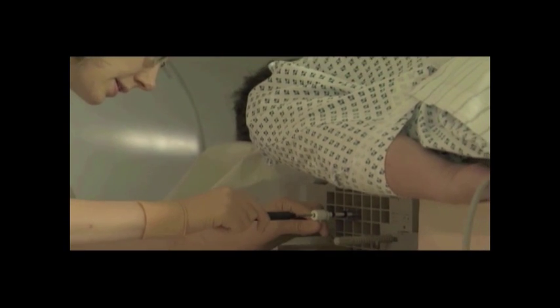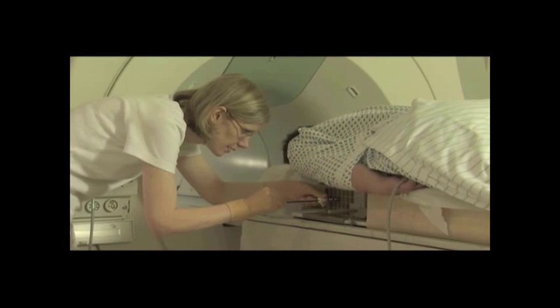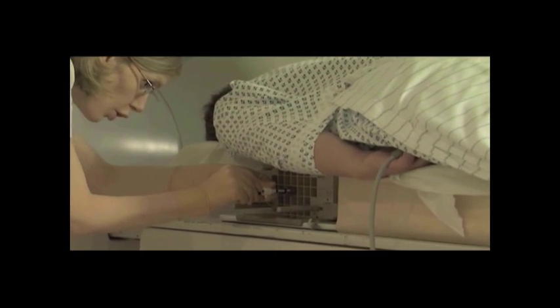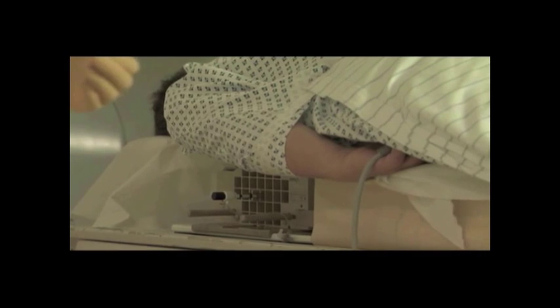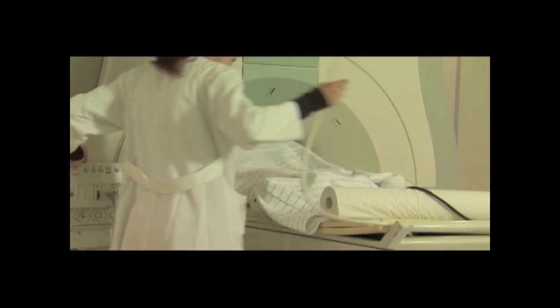While continuing to hold the introducer sheath in place, remove the stylet. Place the localizing obturator into the introducer sheath. Make sure that all instruments placed into the introducer sheath are inserted completely, hub to hub. Ensure the sidearm of the introducer sheath is tucked in near the grid to avoid catching on the magnet.